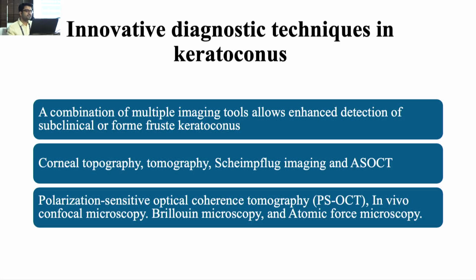To conclude, I would say that the innovative diagnosis should include a combination of multiple imaging tools to enhance the detection, not just a single topography or tomography. So basically, you should have a topography, Scheimpflug imaging, and ASOCT. And the other things which I have mentioned are the future directions which we need to work upon.